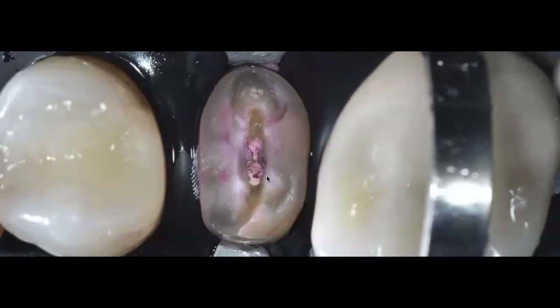Keep in mind that in the center of the tooth, near where the pulp chamber was, there's a lot of collagen fibers, so you're going to get some staining there. So I'm not going to go, you're just removing all the dentin there, because you will end up with no tooth structure. But I 100% certainly want to make sure that I have a nice and clean peripheral seal zone.